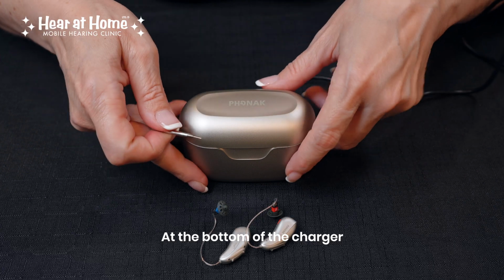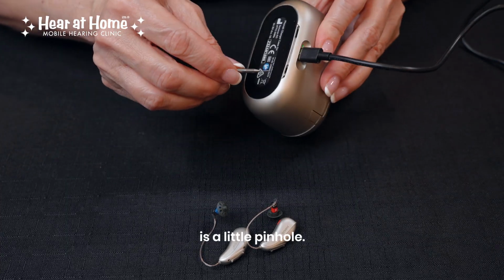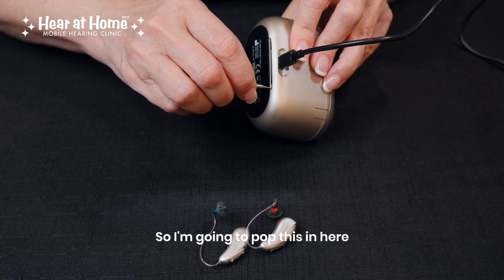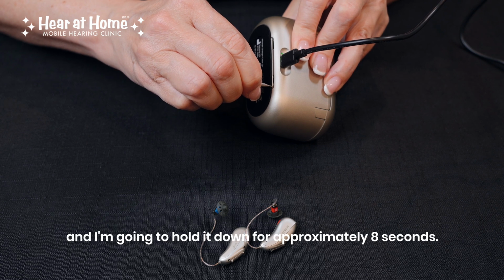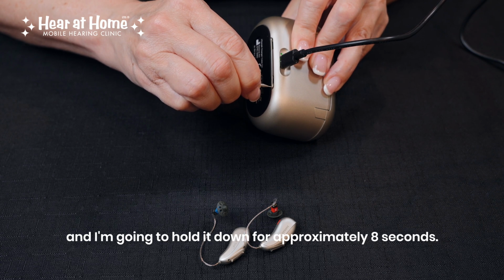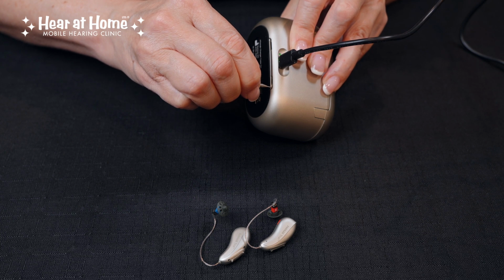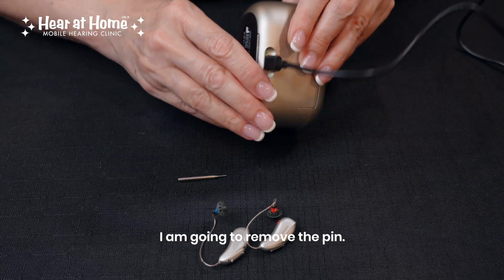At the bottom of the charger is a little pinhole. So I'm going to pop this in here and I'm going to hold it down for approximately 8 seconds. After 8 seconds, I am going to remove the pin.